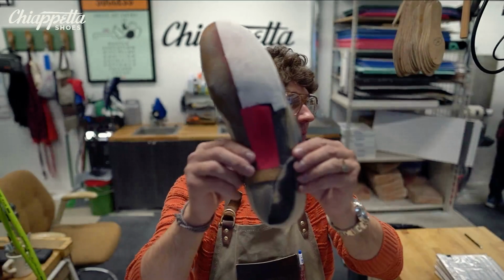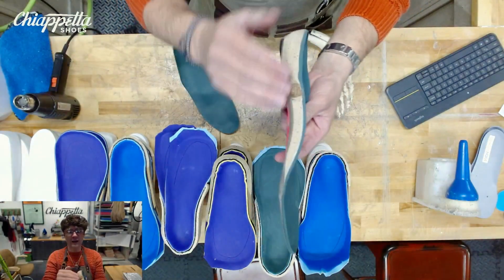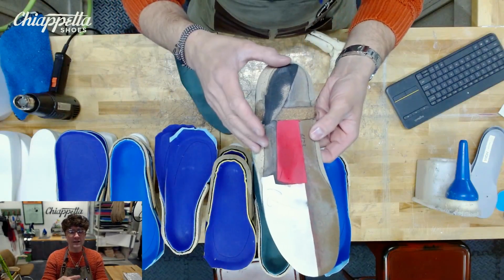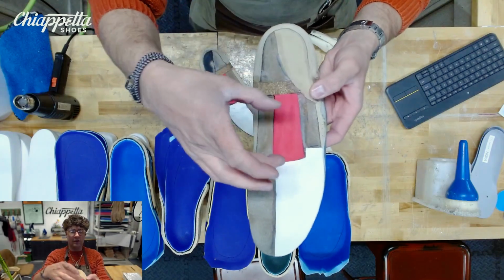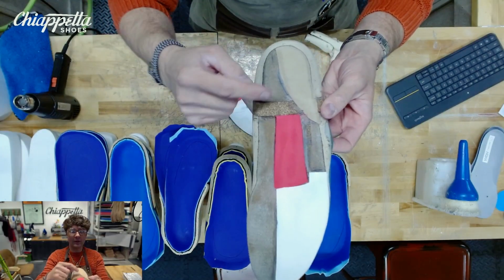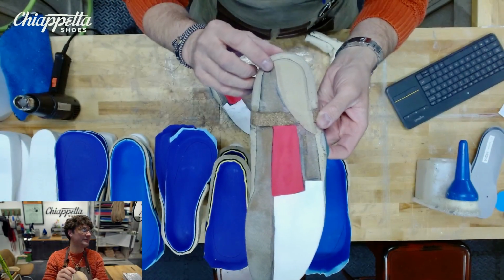So what we started with, let me go top down here, was a good custom orthotic. We have a 3-layer EVA, CHK, and cork. Underneath, we went with a midfoot longitudinal arch bar, rear foot calcaneal bar, and then a lateral wedge on the heel. Now, I don't like these all that much. I know I've talked about it a number of different times.